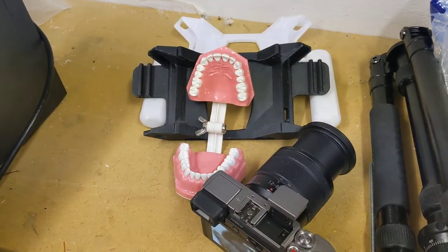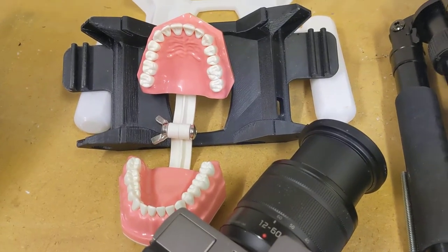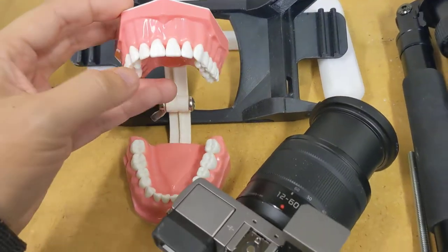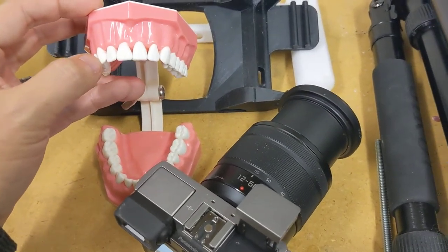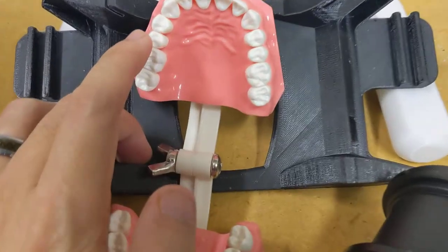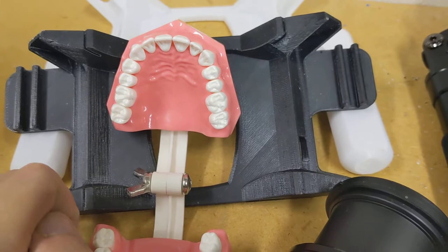So those are two different ways to use the focus and recompose technique. To summarize: from the front, you focus and recompose on a lateral or canine. From the occlusal view, you focus and recompose on the first bicuspids — the fours, for you orthodontically inclined people.